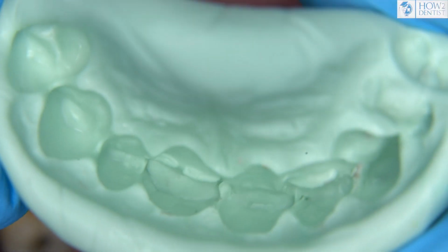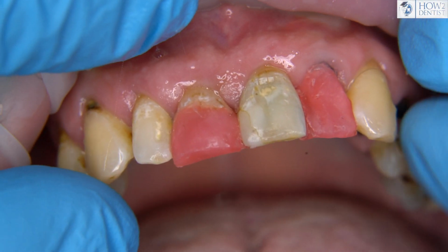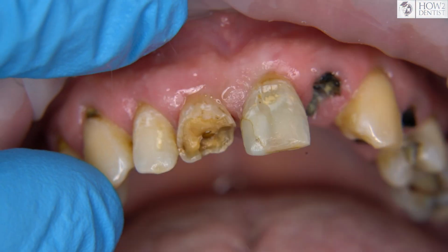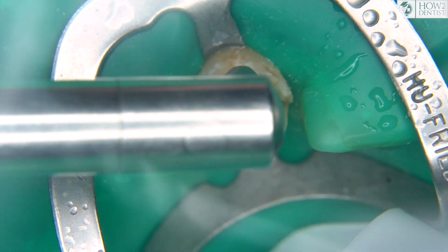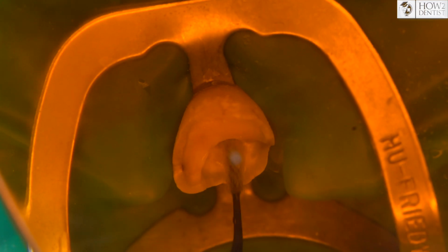After that, the wax is removed. It's clear that on teeth 1-1 and 2-2, replacement of restorations and restoration of the stump of the teeth is required. For this, we insert posts and use build-up core material. Of course, we will produce a separate video about how to choose a post, fiberglass or titanium, but in this case we use a titanium post and build-up core materials.